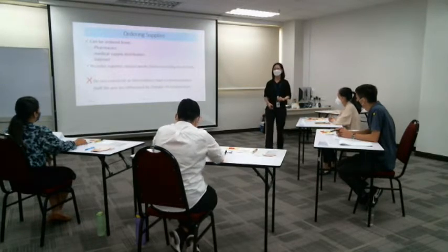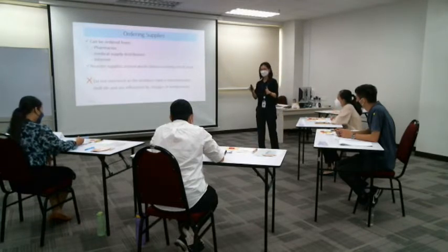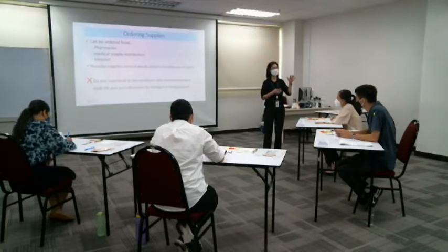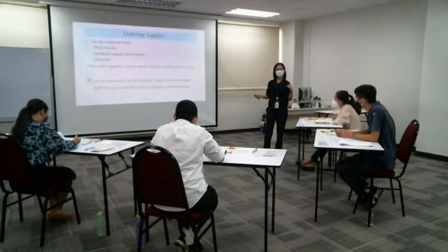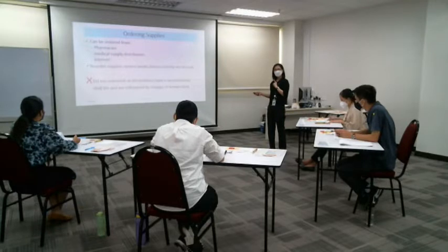So that's no good, because all the products will have a shelf life. Shelf life means that it will be good to use within this period of time to this period of time. And also, if you keep too many stocks, you have the risk of them getting damaged because of the temperature, or the heat and humidity. All right, okay.